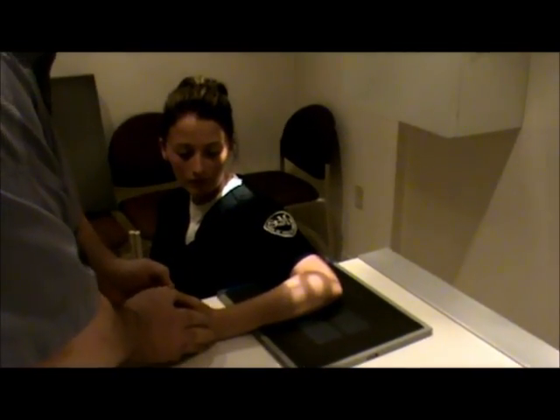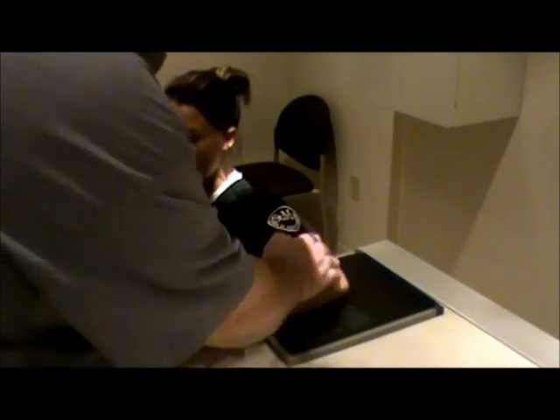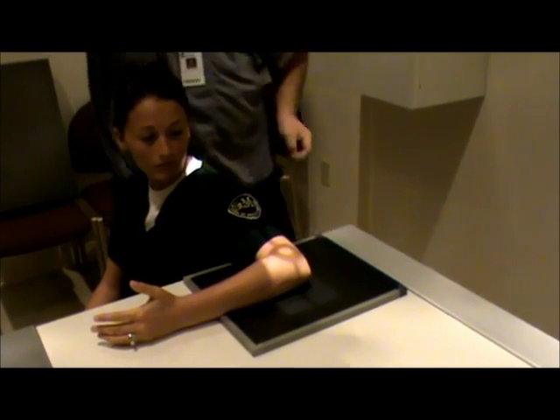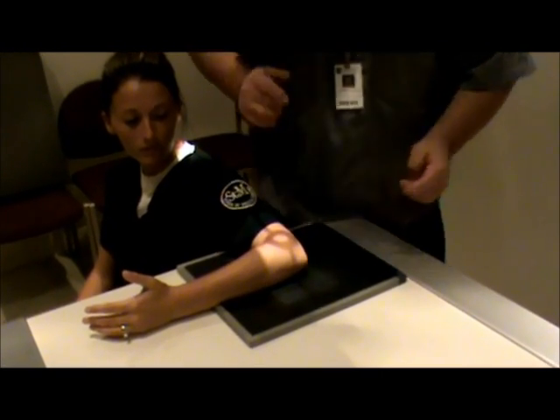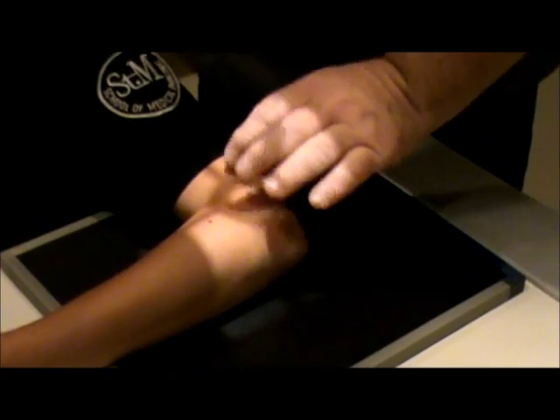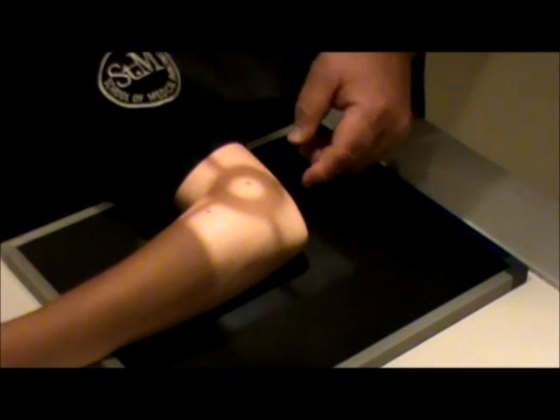Now we're going to do the lateral elbow. You're going to have the patient flex the elbow 90 degrees and have them turn the thumb until it is up. We're going to rotate the film and center vertically and horizontally. The centering point is going to be the mid elbow joint. We want to make sure that we include the entire joint and a couple inches of the forearm and of the humerus.